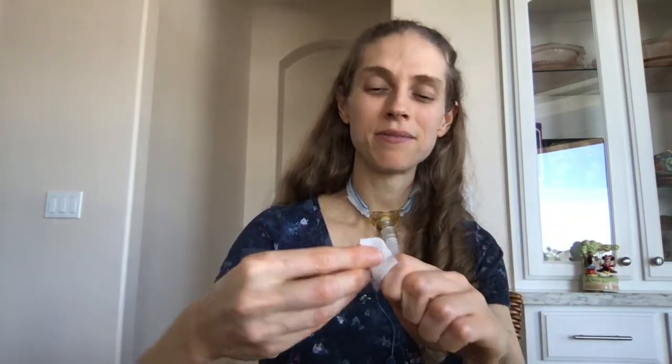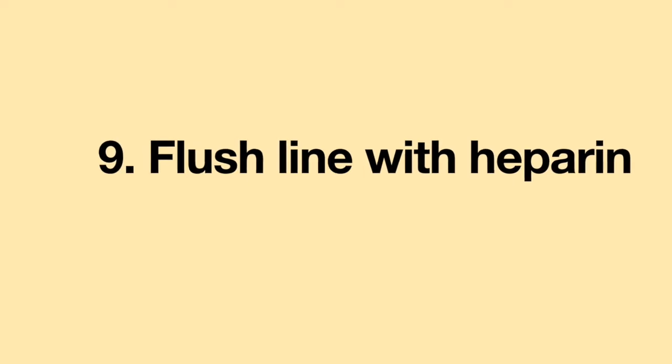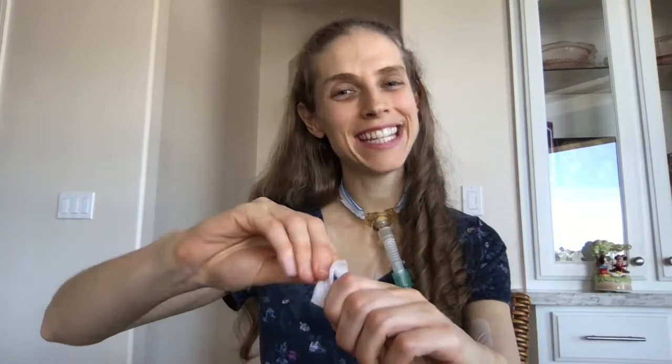Once the saline is all infused, unscrew and discard it. Pick up another alcohol swab, open the package, and scrub the top of your IV line for another 15 to 20 seconds. When done disinfecting, discard the alcohol swab and pick up your heparin. Hold the heparin in the middle, untwist the top, push down, twist on, and infuse the heparin.